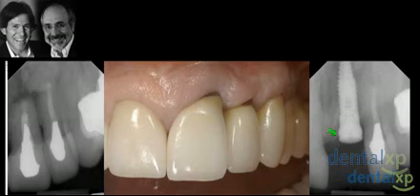And an implant was placed, and one of the problems that we see immediately when the implant was inserted is the location of the implant in terms of how close it is to the lateral incisor, number one. Number two, for David and I, is, this implant really, from the onset, we have a soft tissue discrepancy between the right side and the left side. And therefore, we really have to consider this situation, the labial soft tissue recession, as well as the interdental recession that's already present before we even start in this situation.